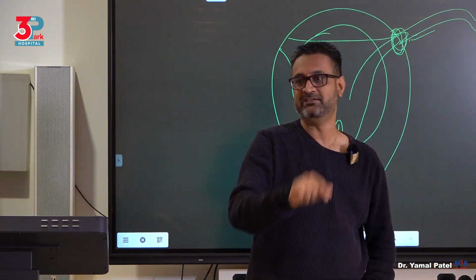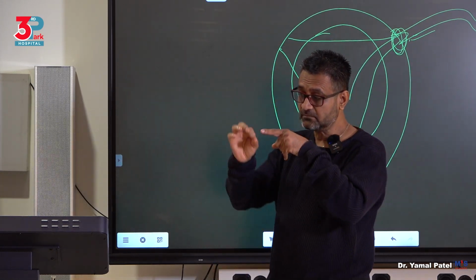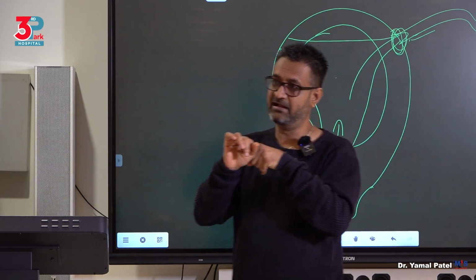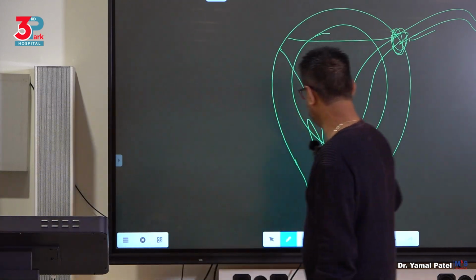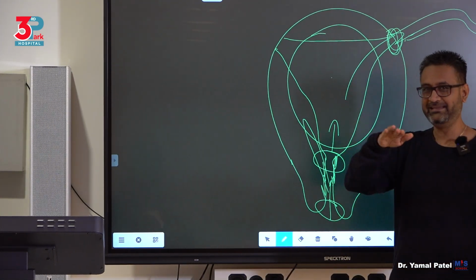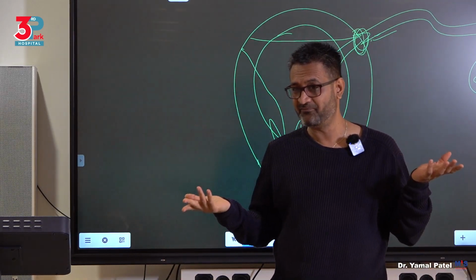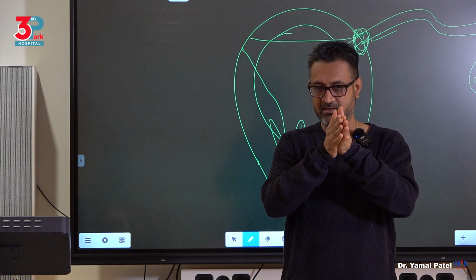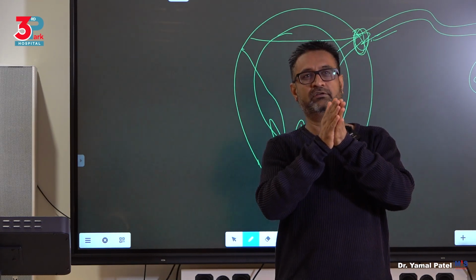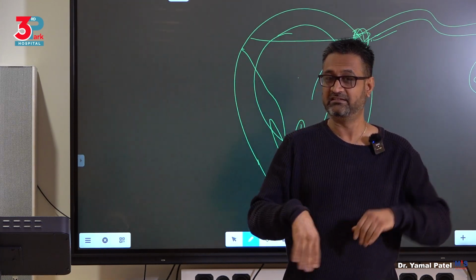And then you go into the uterine cavity. You've understood? Under vision. Now, once you enter into the uterine cavity, you follow the track of this. So whether it is anteverted, retroverted, irregular, it doesn't matter. I'm following the view, and I'm pushing only when I can see. When I don't see, I'll stop again, I'll look around and then say, okay, here. Then you go ahead. If there's stenosis, doesn't matter.